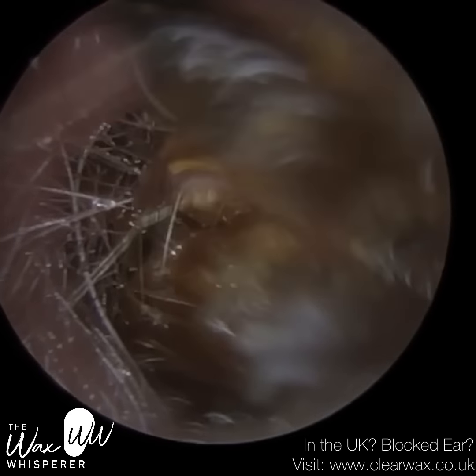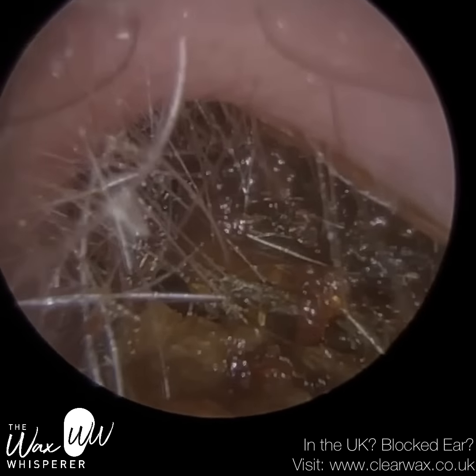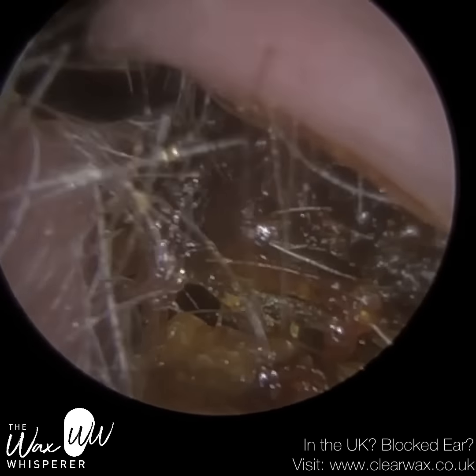We're right near the entrance, though complicated by all these hairs. These hairs should only be found in the outer third of the ear canal — the cartilaginous portion.